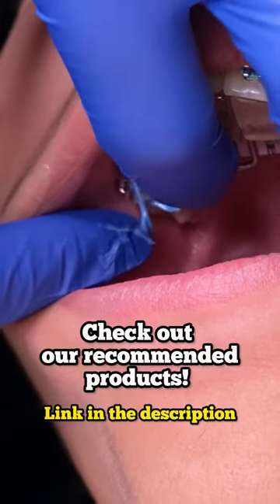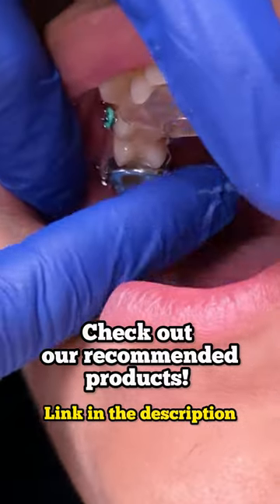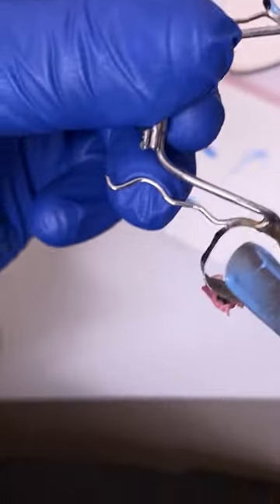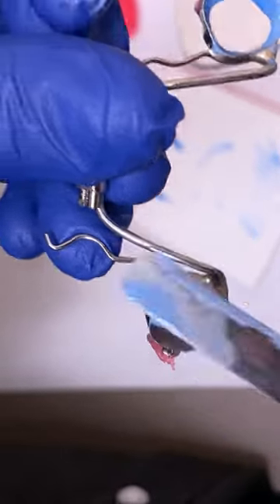A water flosser is going to be very important to make sure all of that plaque and debris doesn't get caught up and around the appliance, especially right here with the bite plate.